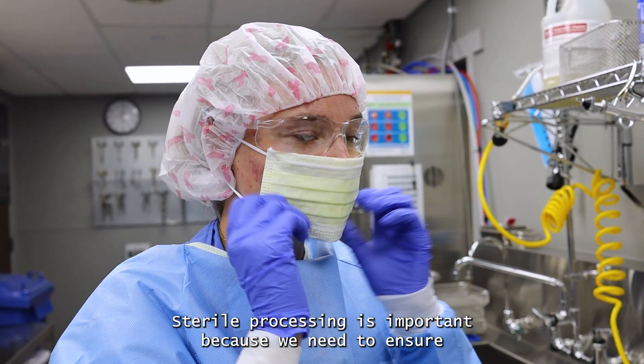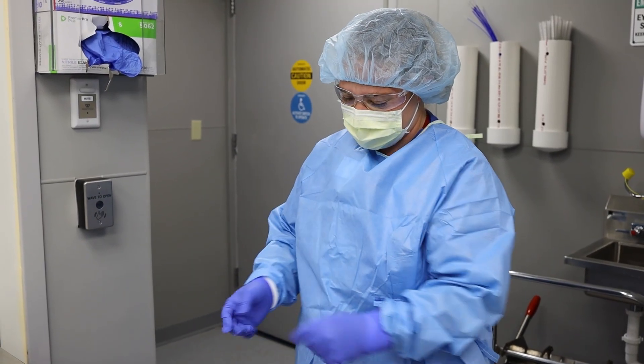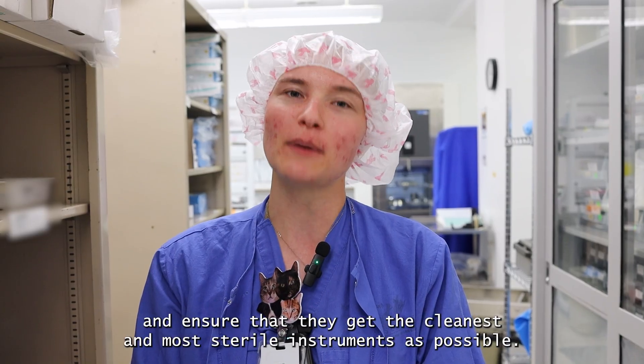Sterile processing is important because we need to ensure all the instruments are clean and sterile to prevent infection. Kelly and I like to treat each patient as if they were our friend or family member and ensure that they get the cleanest and most sterile instruments as possible.